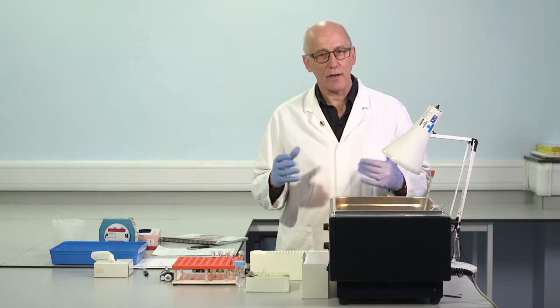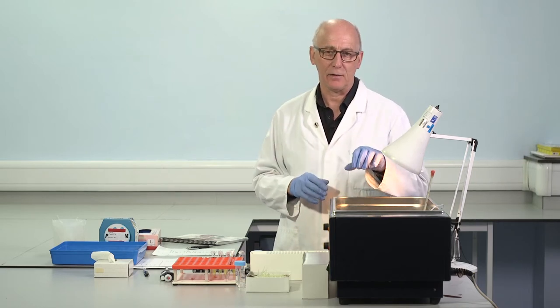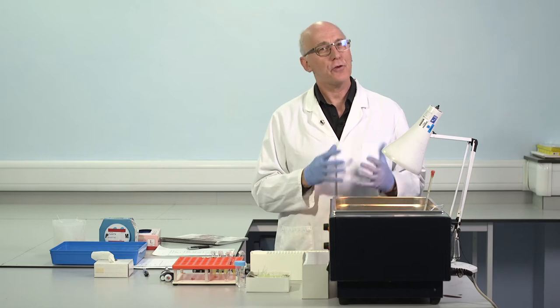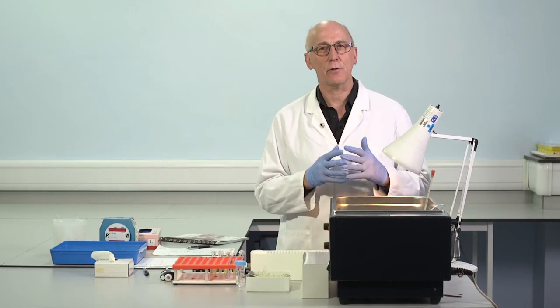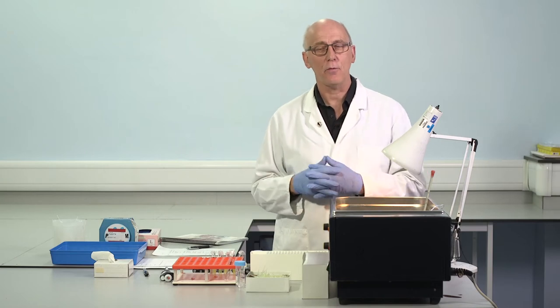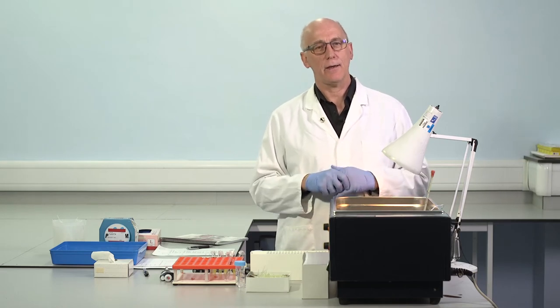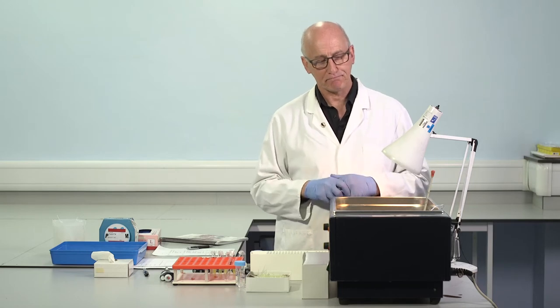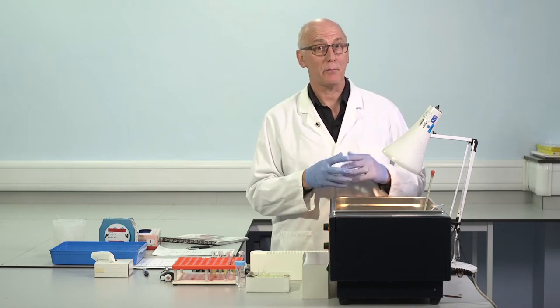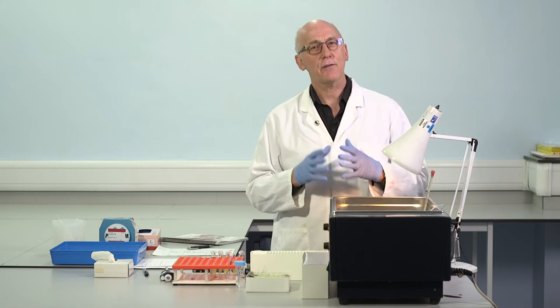It's acceptable to use lyophilized controls, but I think there are some advantages also to using frozen materials. The properties of the control material should be as close as possible to patient samples. And if we use frozen controls, we have less potential to introduce changes. It's ideal to begin with patient samples for the abnormal, and this is why I think it's useful if ethical rules in operation allow us to harvest residual plasma from patient samples. If we do this, then it's acceptable to make a series of small pools. Perhaps this is done on a series of different days, 20 mils today, 20 mils tomorrow, 20 mils over a series of days, and these can be deep frozen.